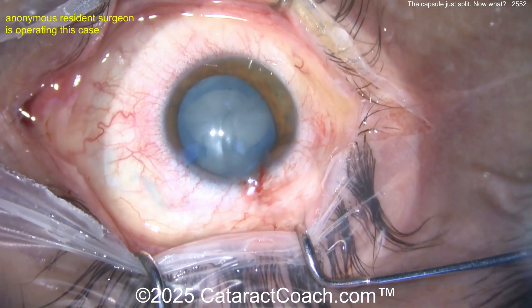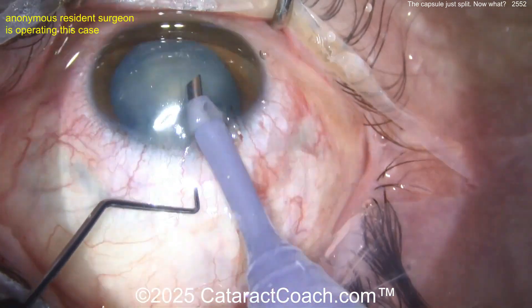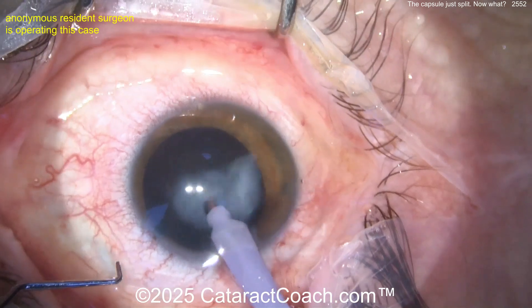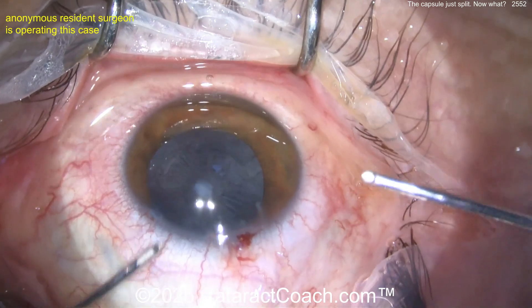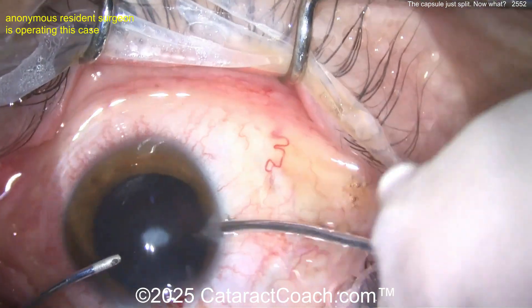Now you have a nice large opening — let's aspirate this out. Using a little more magnification here, going into the phaco probe, and there's nothing to groove. Look — it just crumbles apart and it's just gone. This is a typical intumescent white cataract in a young person. Look at those eyelashes — reasonably draped, thank you for that. Now going in with manual IA.